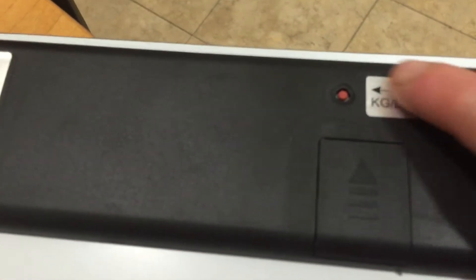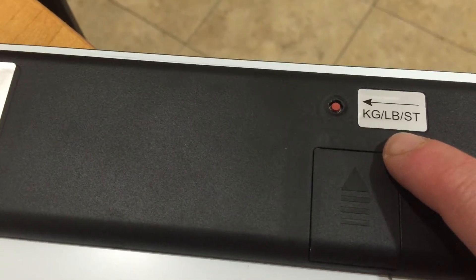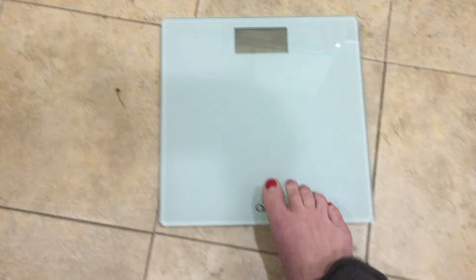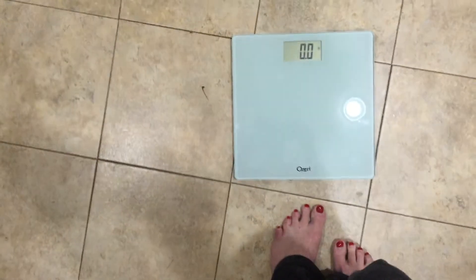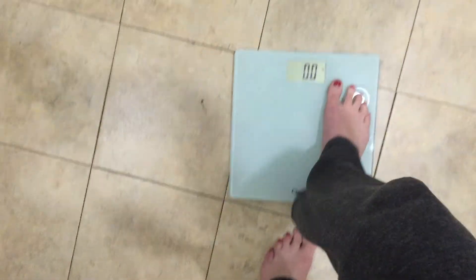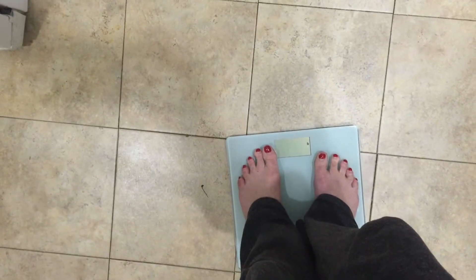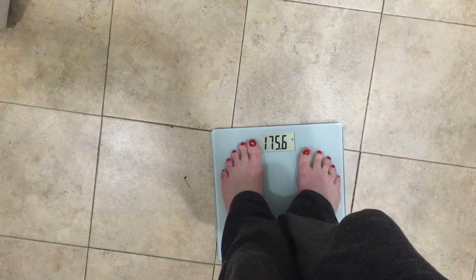It looks like it changes between kilograms and pounds. I'm not sure how the setting is when I turn it on. I like the nice design of it. It also goes up to 400 pounds, which is useful. It looks like it defaults to pounds and it says I weigh about 175 pounds, which is probably accurate.